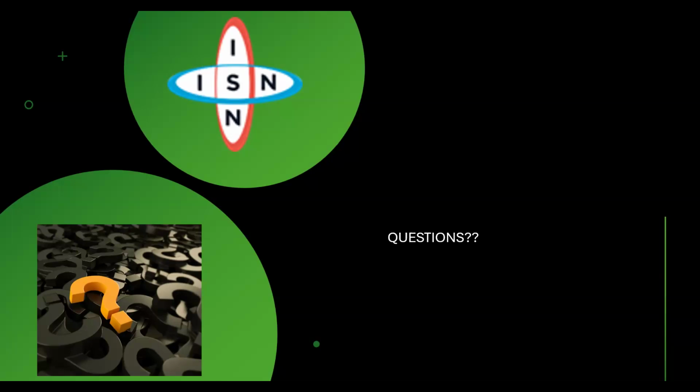Hello, can you hear me? After this meeting, I will send a procedure for your maintenance, like a maintenance checklist, if possible, so you can see the daily maintenance, the weekly, and the monthly, and as needed too. So, thank you very much. Next question, please.